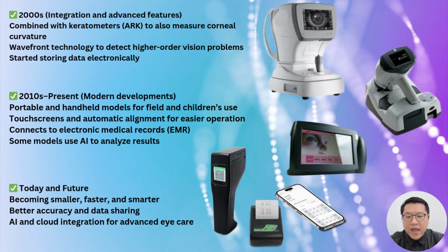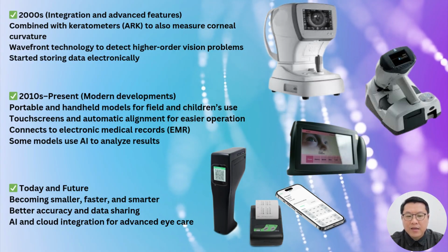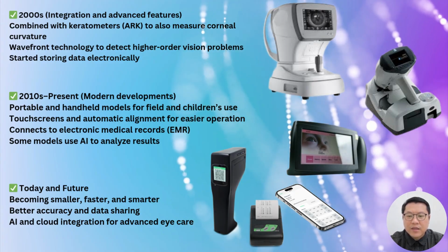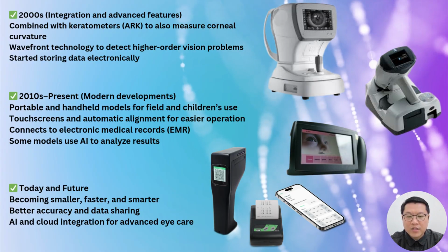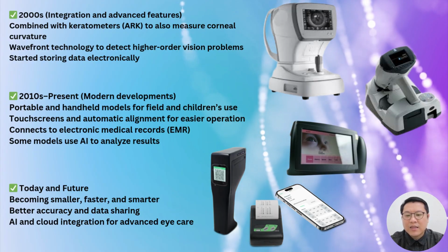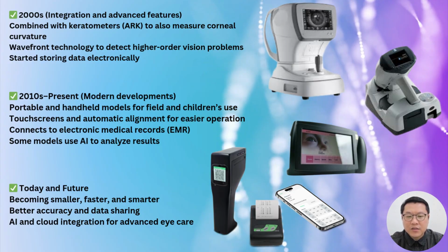The autorefractor has developed from a bulky, basic machine into a compact, intelligent digital device. This reflects the broader shift in healthcare towards automation, portability, and smart diagnostics, making eye care more accessible and efficient for everyone. Thank you, Mr. Wong.